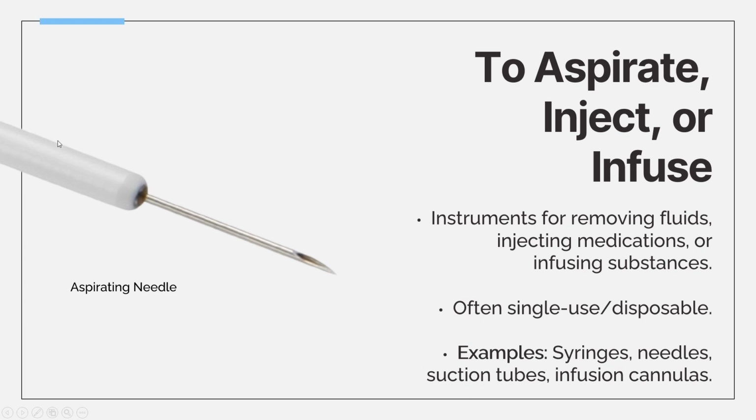A lot of the time these instruments are single use or disposable. And I believe it's the injection needles, we never reprocess these, or at least I personally have never had to reprocess injection needles, only syringes and some aspirating needles.